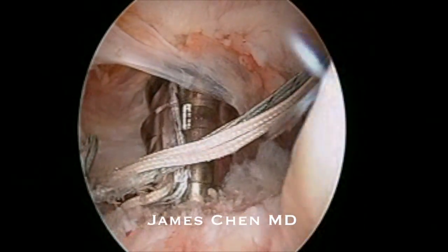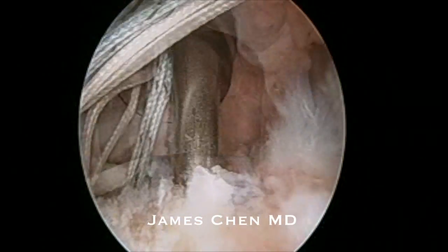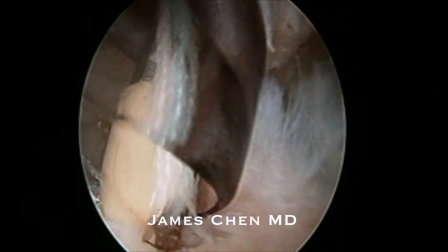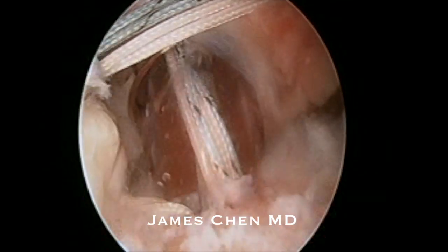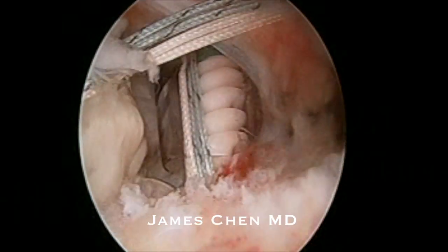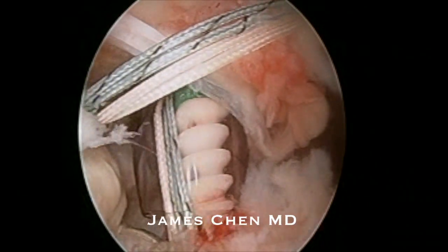I have loaded two of the sutures into a 4.75 swivel lock. I have punched a hole in the lesser tuberosity. Here I am impacting the swivel lock anchor and then screwing it in tightly, which reduces the subscapularis tendon to the lesser tuberosity.